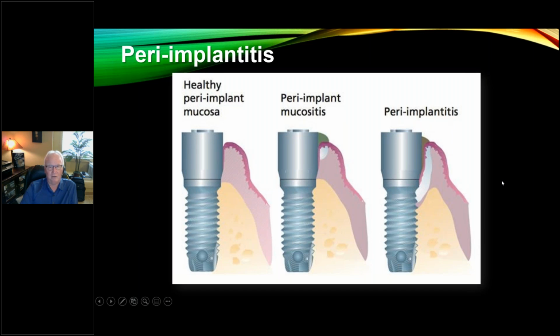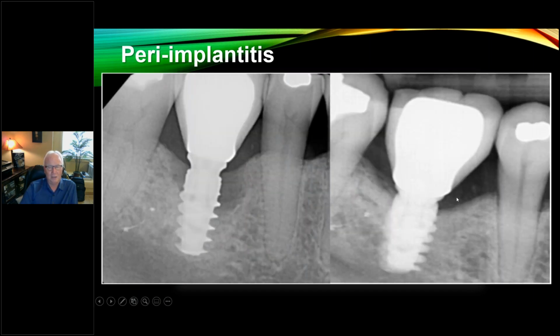And there are criteria for making these particular distinctions between a mucositis and a peri-implantitis. And you guys know far better than I do. I know what I see in the radiographs. These are 2 digital images. If it looks like this around the implant, it's probably okay, but I'd want to see other information, maybe even cone beam. People say, oh, look, that bone is integrated into the thread. Yeah, well, that's 1 degree of 360.